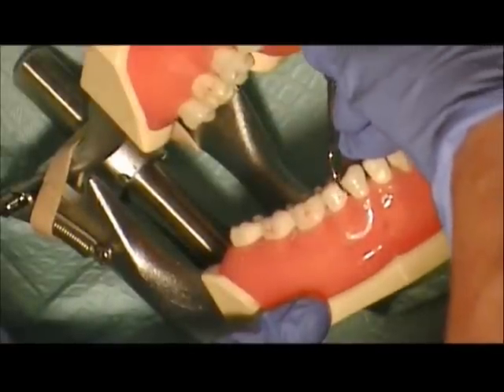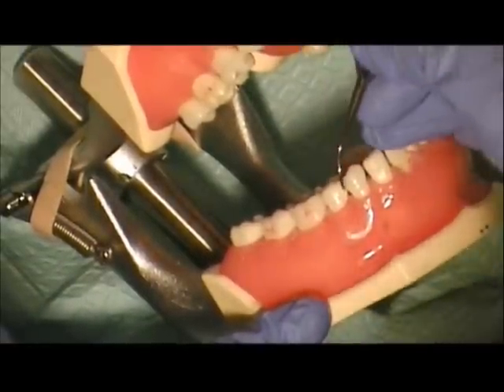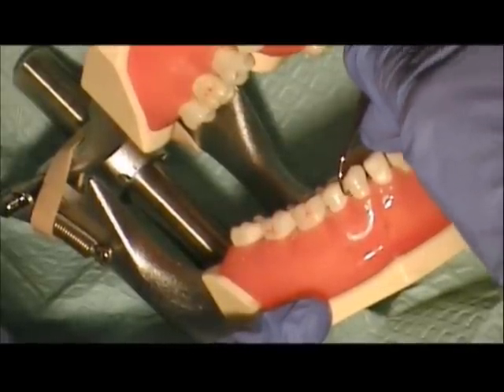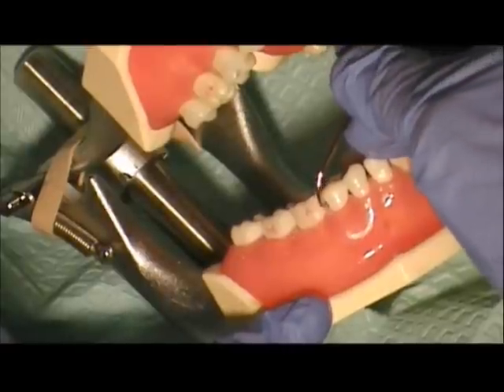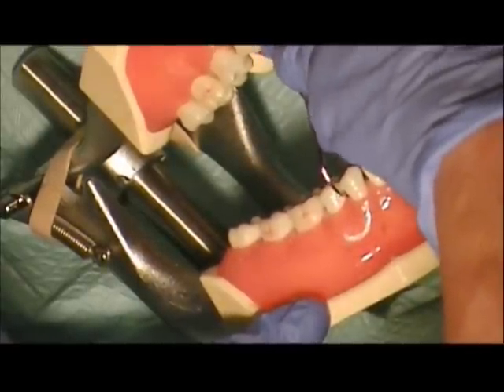Going from the mesial of the premolar, tooth number 29, we can go right on to the distal of tooth number 28, tip to 70 degrees, then work on the distal. Therein lies the beauty of the universals — where you're doing the distal of the tooth and then right to the mesial with the same instrument.